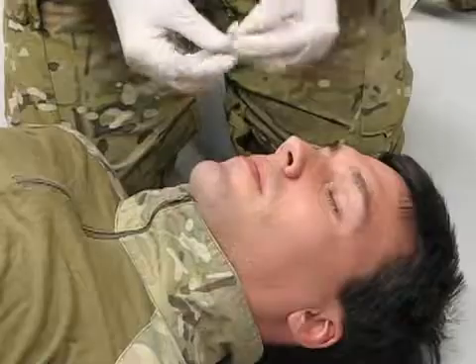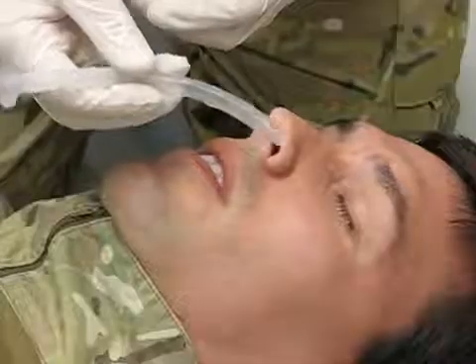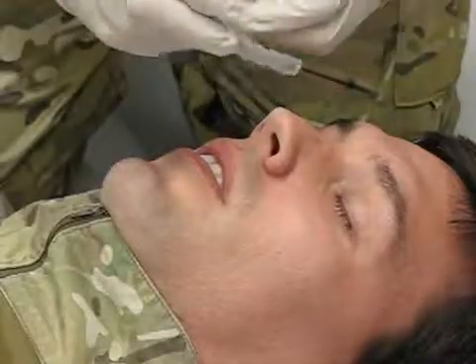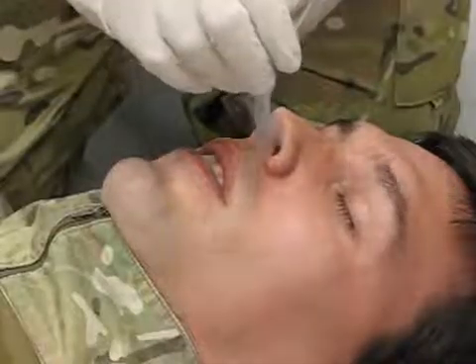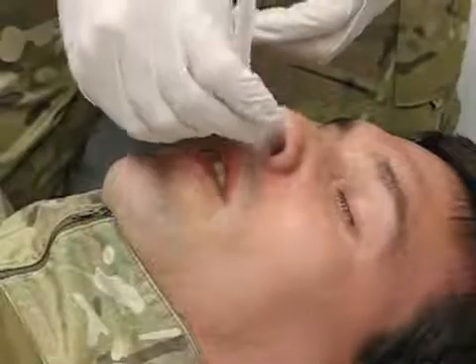Lubricate as much of the tube as possible. To insert the NPA, ensure the bevel is to the septum and gently insert. Notice the medic is not orienting the tube towards the top of the head. Instead, he is directing it almost straight back towards the back of the head.